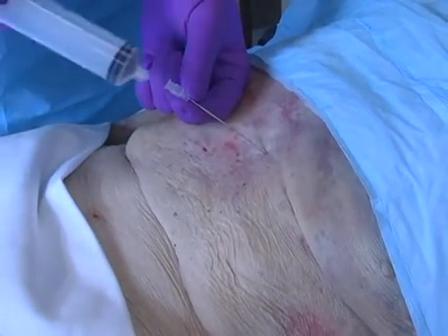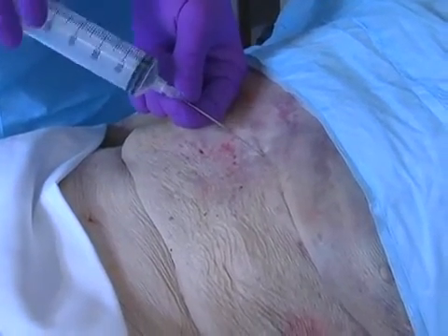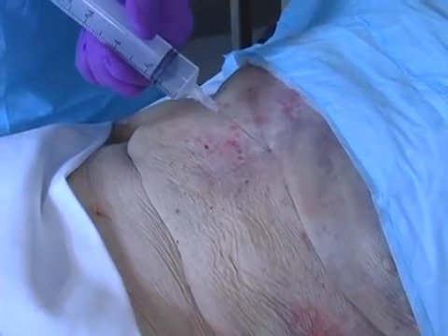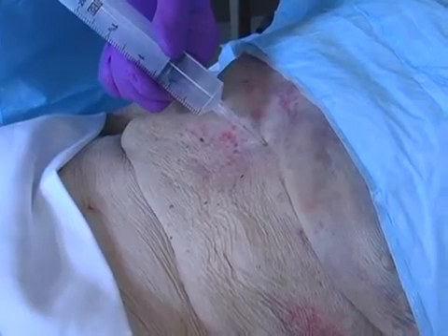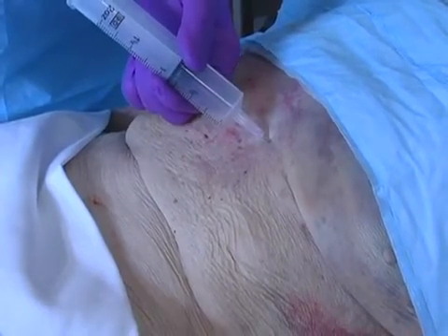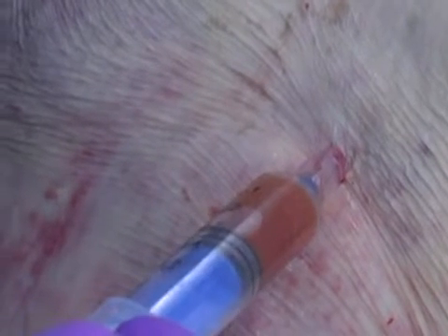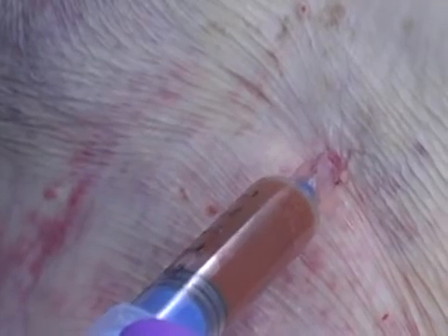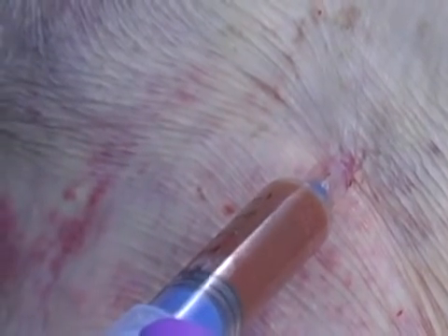If using a regular needle from a central line kit, you will want to have a small amount of sterile saline in the syringe to get rid of the skin plug. Attach the syringe and aspirate as you advance the needle toward the left shoulder. Look for return of fluid when you enter the pericardial space. Also look for return of vitals. You may not need to draw off a significant amount of fluid to see a return of vital signs.